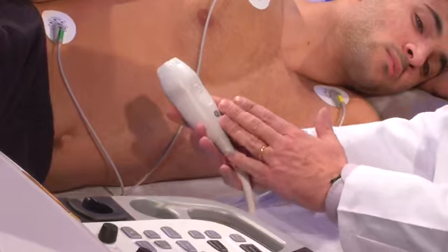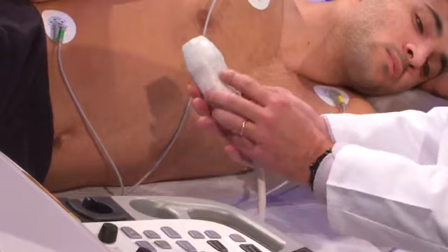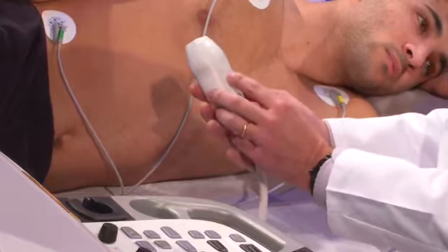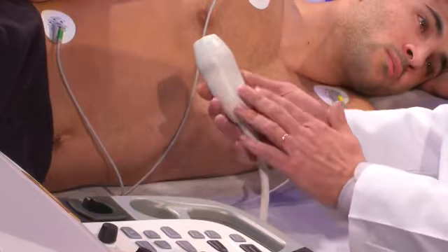3D echocardiography is one of the major innovations in the field of cardiac ultrasound. It allows us to acquire and analyze every structure from every point of view. For that, of course, we need a specific probe, and this is the probe that we will use. You can see this probe is slightly bigger than a usual probe that we use for 2D, and this may, of course, give some limitations.